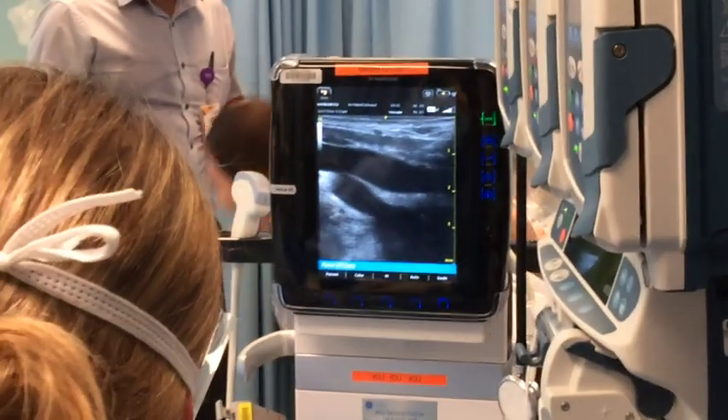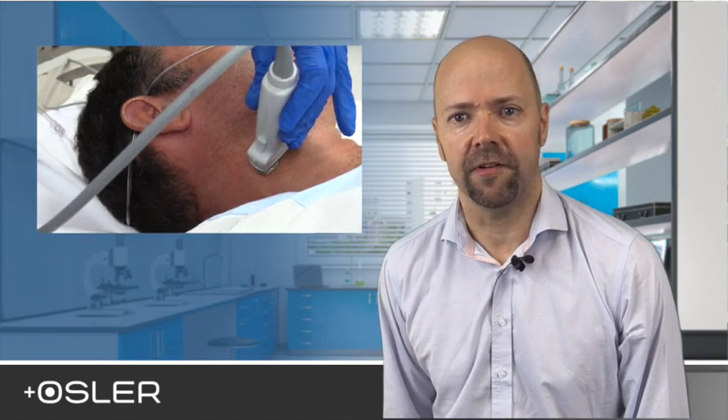The biggest challenge is to identify it before you break your sterile field, which gives you the chance of repositioning the catheter tip. Ultrasound is the perfect way to achieve this. Once you've fed the catheter and no longer need the ultrasound to remain sterile, ask your assistant to scan the internal jugular vein for you. This can quickly identify in real time when this troublesome complication occurs.